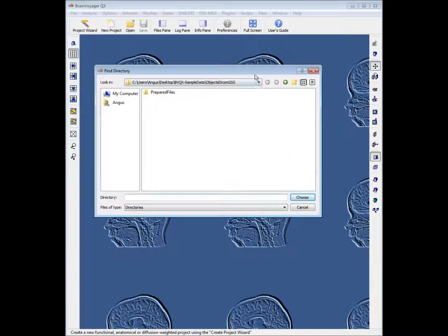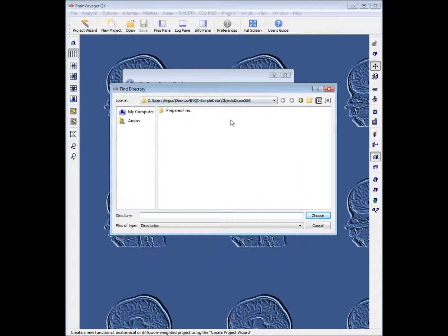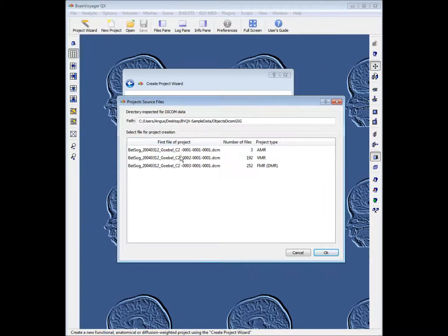We want to browse to where the data is located. The data comes from brainvoyager.com — you can download it there. Browse through the folder; typically it will look empty but it's not, so if you choose the folder you'll get a list of what's actually in it.